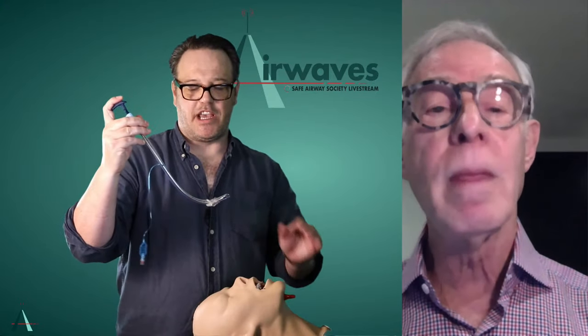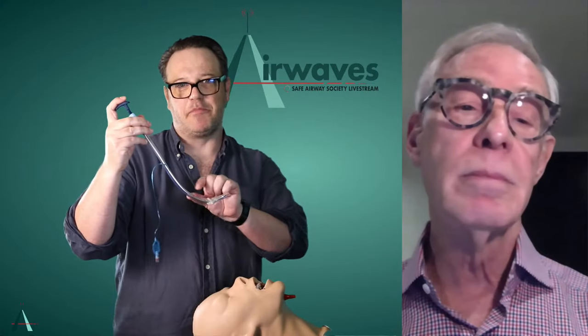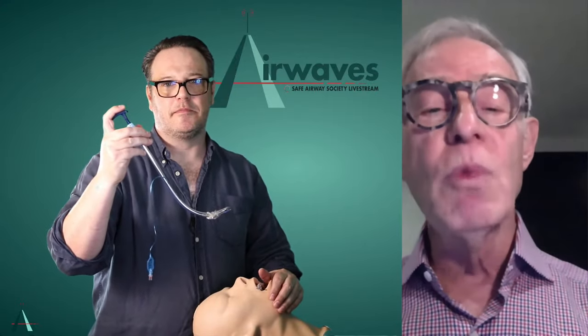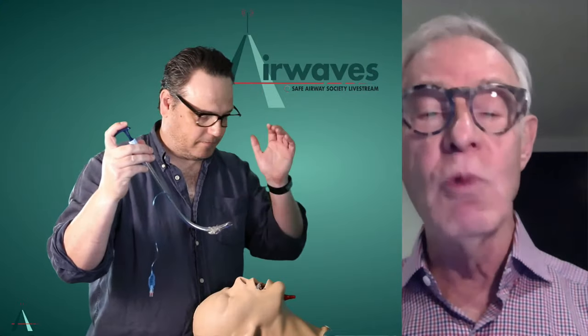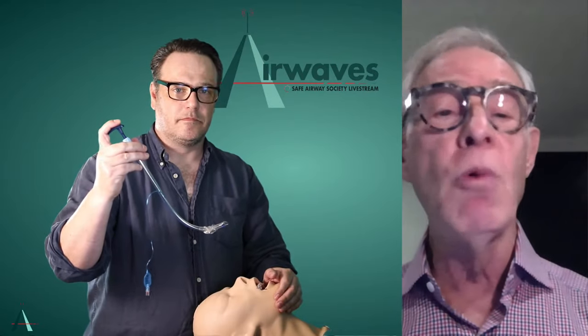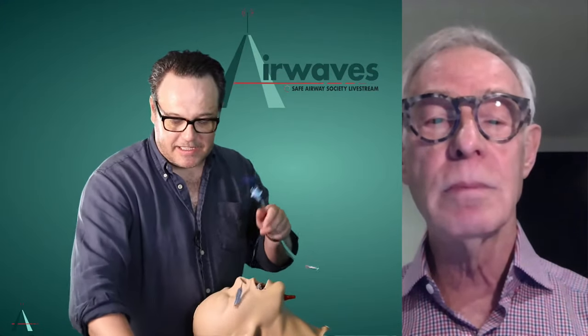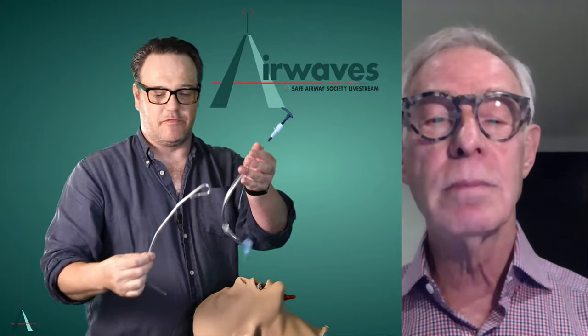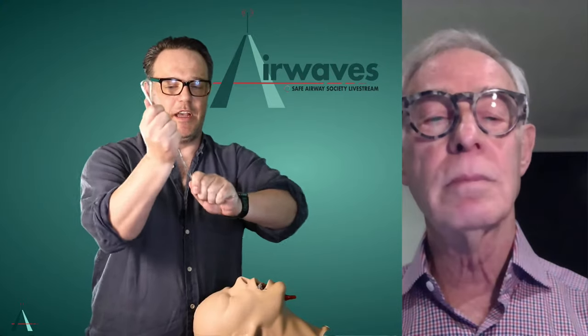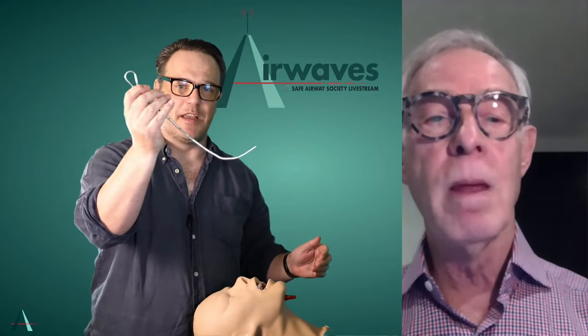So when you say a droopy J, when you're using the malleable stylet, I'm getting the impression you would have a slightly less curve than this on the rigid stylet. Is that right? I'm perfectly happy with the shape of that stylet, but when I do it, I tend to be a little less angulated than that, but not significantly. That shape will work perfectly well. But you can do exactly the same thing if you don't have access to these rigid stylets. You can do exactly the same thing by shaping a malleable stylet and achieve exactly the same result.